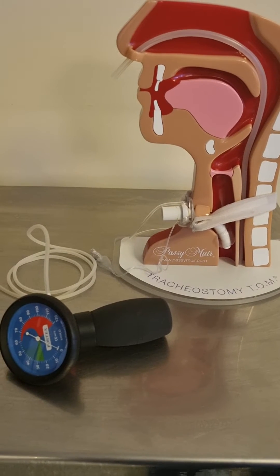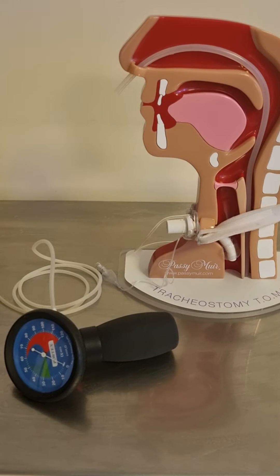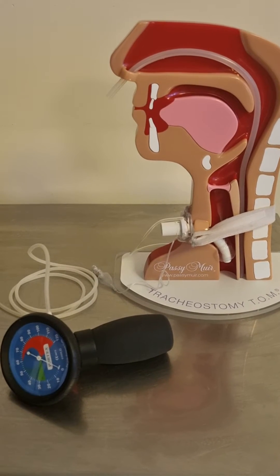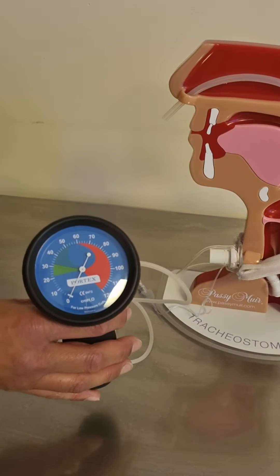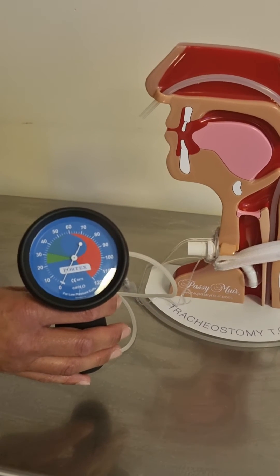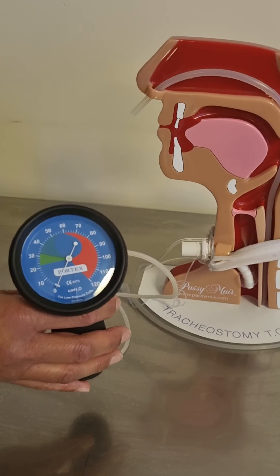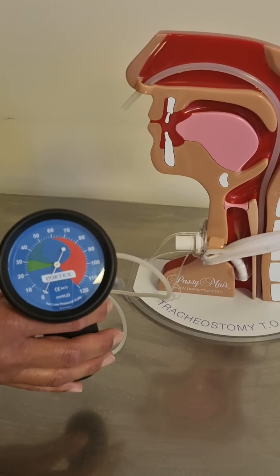Let's go through an example of cuff pressure checks and show you through the diagram an example of a normal cuff pressure and an over-inflated cuff. This is an example of a cuff pressure manometer. It measures in centimetres of water. The normal pressure of a cuff is between 20 and 25 centimetres of water, shown in the green area on the display.